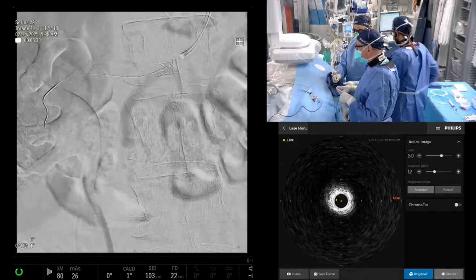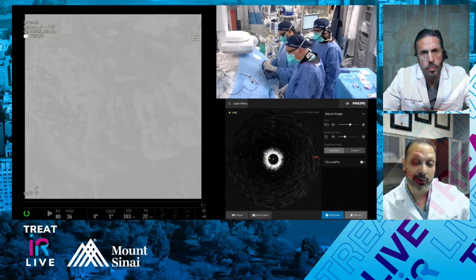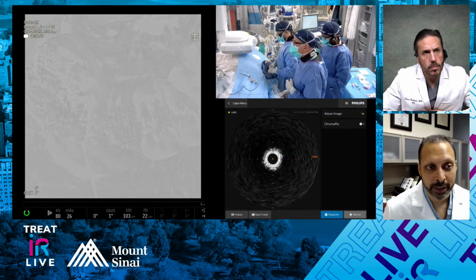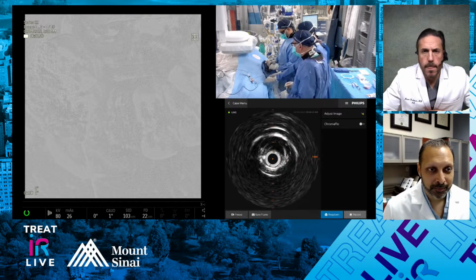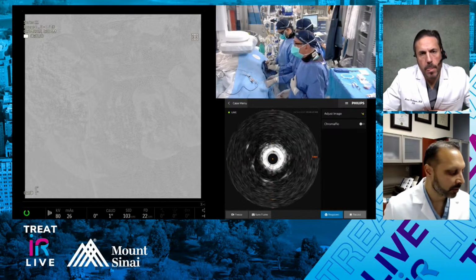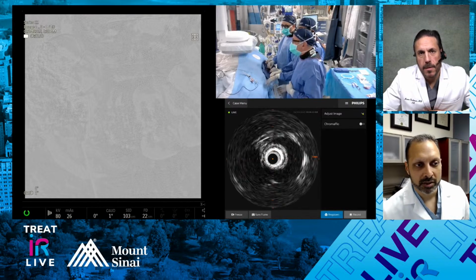Parag, what wire do you use for table side renal intervention? I use an 014, like a Spartacore, certainly a working wire. I mean, your coronary platform wires are great. To deliver a sheath, sometimes I've used tapered wires to get a bigger sheath up, because an 014 wire isn't always going to be stable enough. So, you know, just the old TAD2 wire that tapers down to 018 if I want to deliver a sheath. But frequently I'm working over something like a Spartacore.